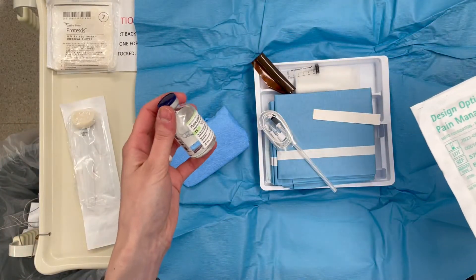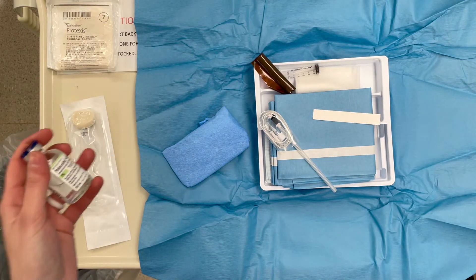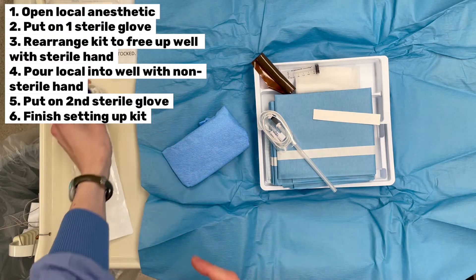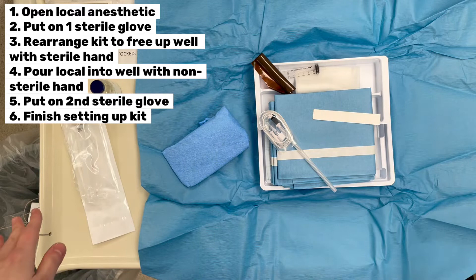This tray is kind of nice because the well is off to the side, and you can just open your stuff up and pour it in. But in this case, if I poured the local in now, the gauze would soak it up. So we're going to put on just one sterile glove, rearrange things, pour our local in, then put on the other glove and finish setting up.